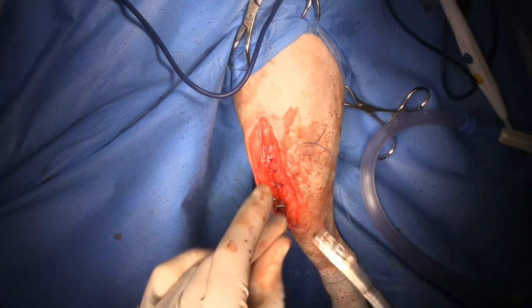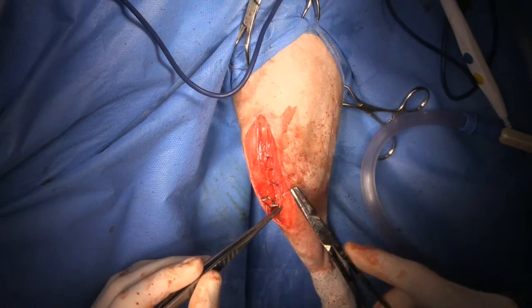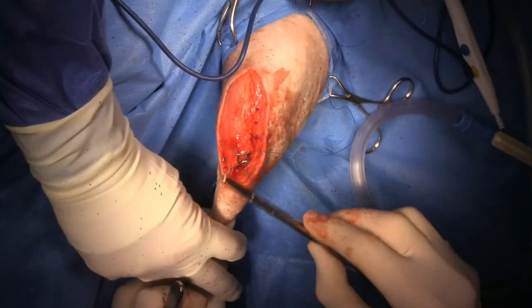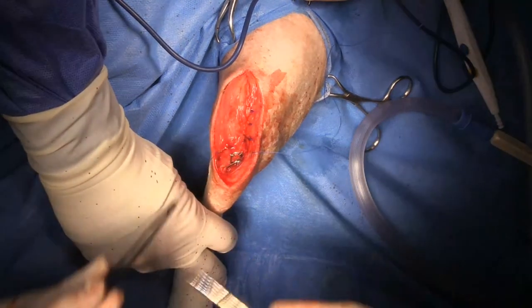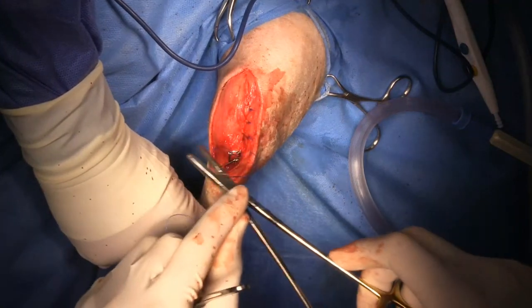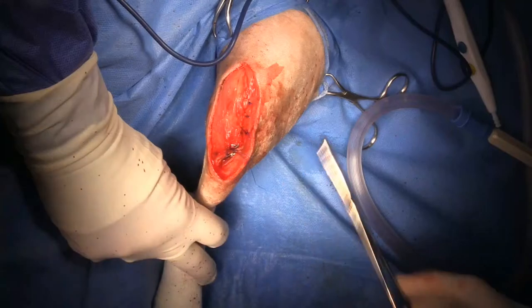I'm going to try to pull that cranial tibial fascia over the top of those pins if I can, to try to reduce the likelihood that we're going to have irritation from those pins through the skin. Not as effective as I would have hoped.